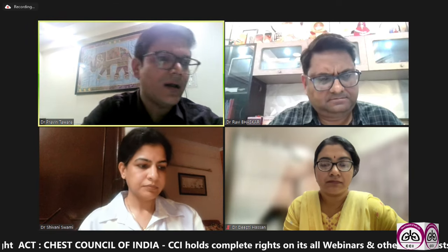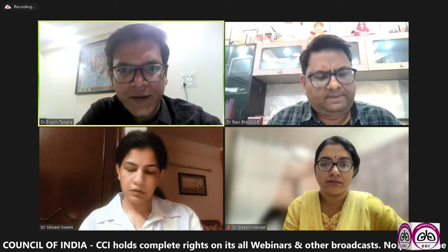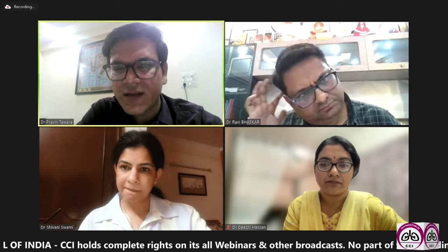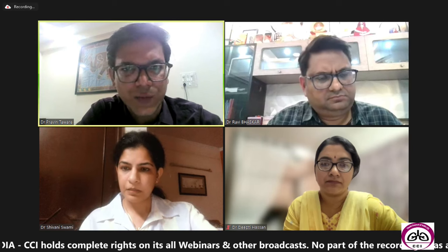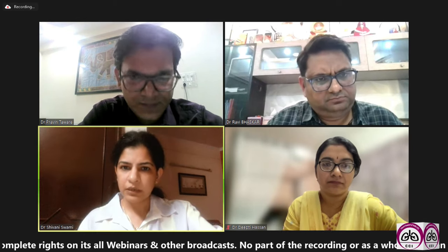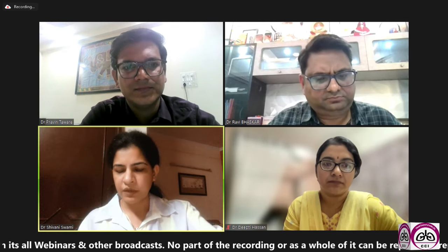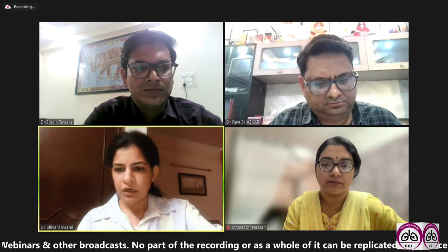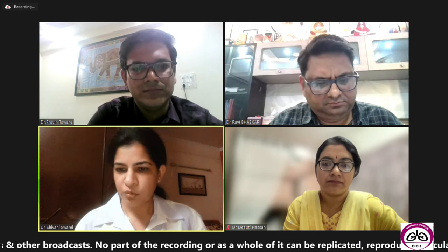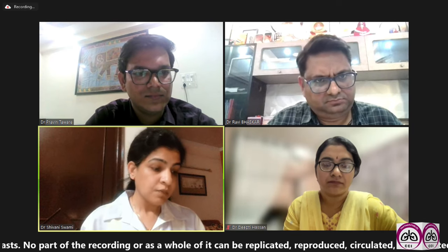So at present, only fine particle DPIs are available for smaller airways and mainly used for COPD and asthma. I think beclomethasone is one drug which is a fine particle and specifically used for small airway diseases. Dr. Jayaraman, sir, I hope that is what you were wanting to ask and we've answered your question.